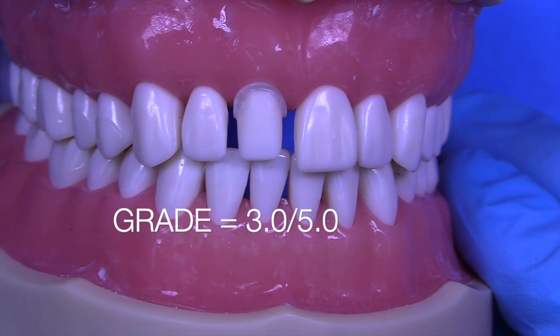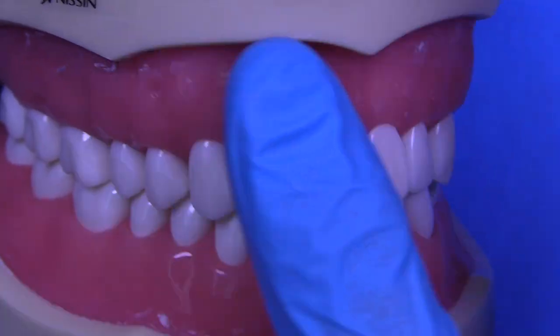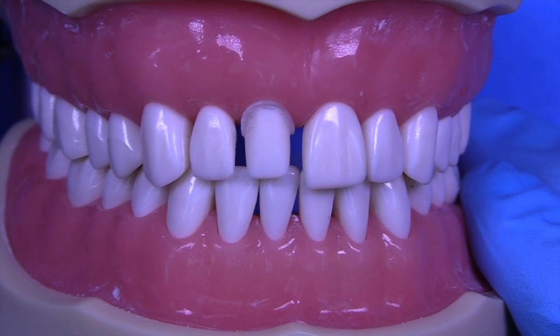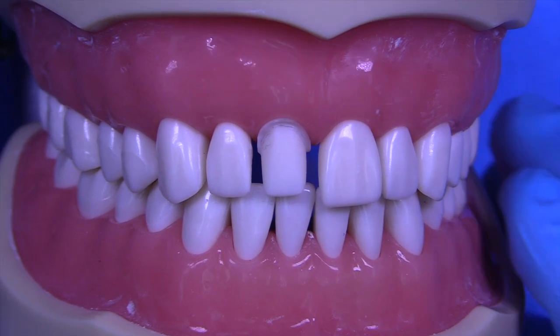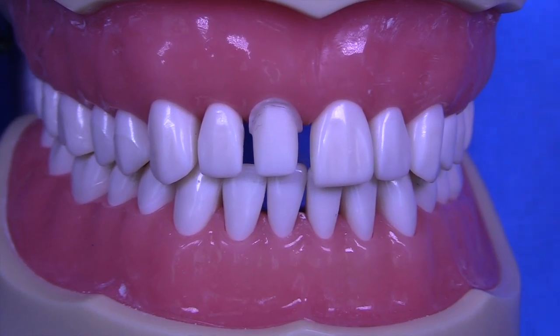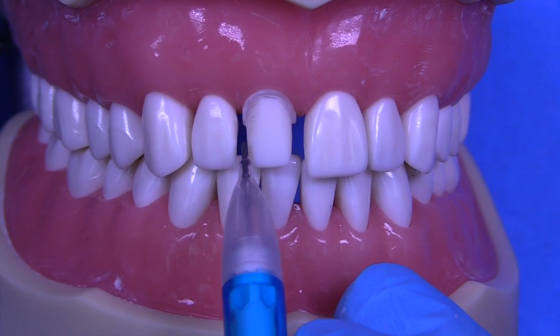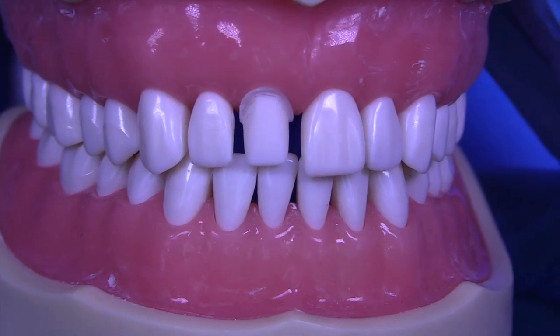I don't think that you did a good job on the operative environment. We need to be a little bit more clean and tidy things up. But the prep was actually pretty nice. The issue is that you just didn't prep enough off the facial. That was really the big issue. That and over here on the distal side, just not enough axial reduction, not enough incisal. In other words, the prep is a little conservative.